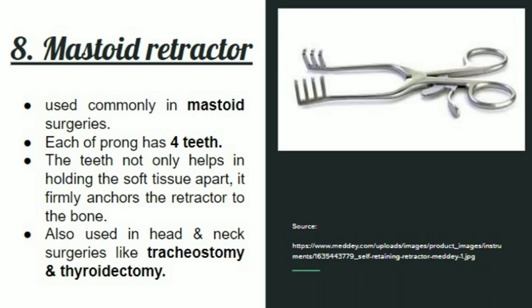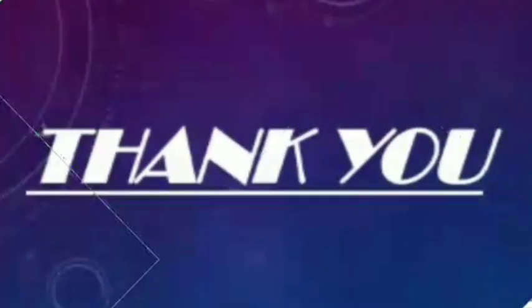The last retractor is the mastoid retractor. It has two blades, each with four teeth. The teeth not only help in holding the tissue apart but also firmly anchor the retractor to the bone. It is used most commonly in mastoid surgeries and can also be used in tracheostomy and thyroid surgeries. Thank you.